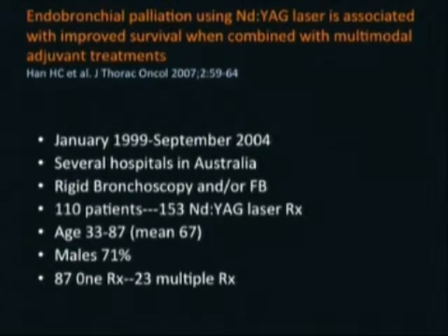And this is just to show you a study showing endobronchial palliation using Nd:YAG laser associated with improved survival when combined with the other treatments. So those treatments have to be combined with chemo and radiation to get improved survival.